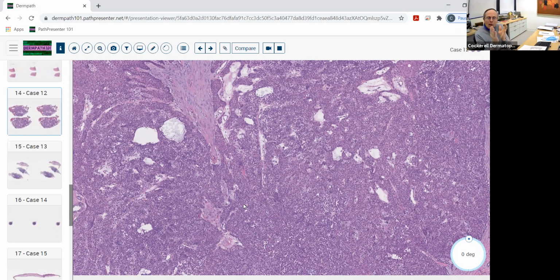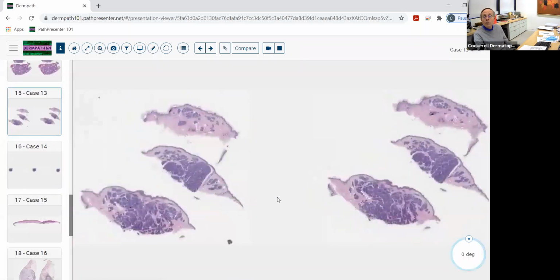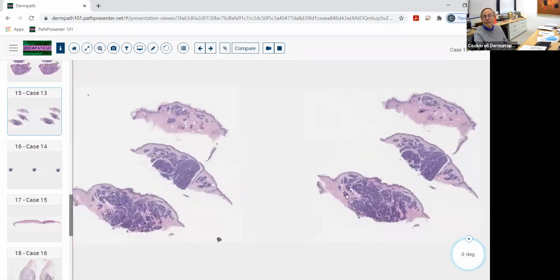You get these little small areas where you get almost maybe 20 or 30 cells together. They all sort of necrose at the same time. That's very common in eccrine poromatous lesions. Doesn't mean malignant. It's almost kind of a clue that you're dealing with a poromatous lesion if you see that. So just remember that's an exception to the rule where necrosis in that case does not mean malignant.